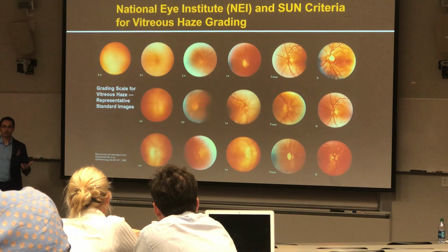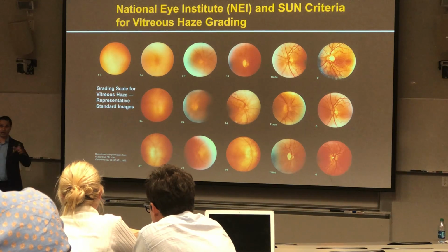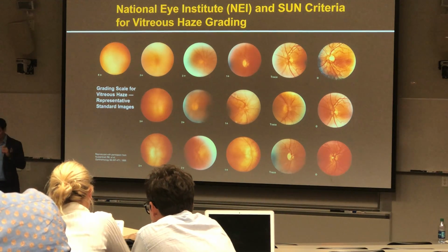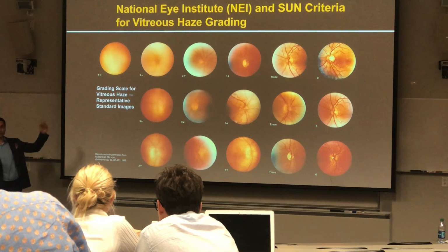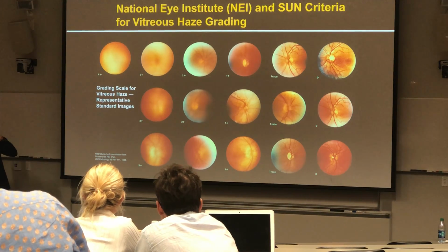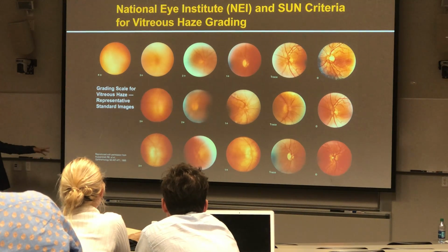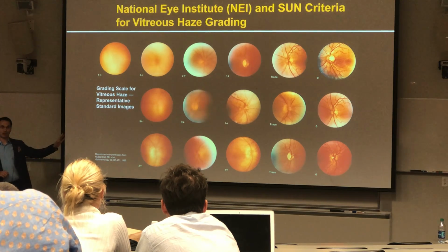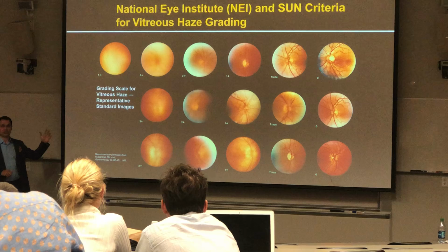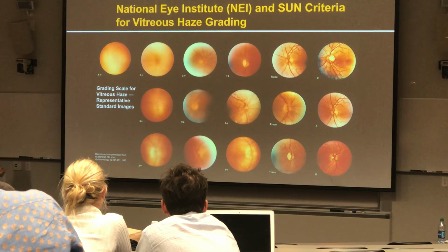The issue that we have seen so far is that a lot of people try to examine the eye, and then they look back and forth between the scale and the eye and try to match it with one of these photographs. However, the actual manuscript came with definitions for each of these grades. So if you follow the definitions, you do not even need to look at the photographic scale to determine whether a patient has 4+, 3+, 2+, or 1+ vitreous haze.